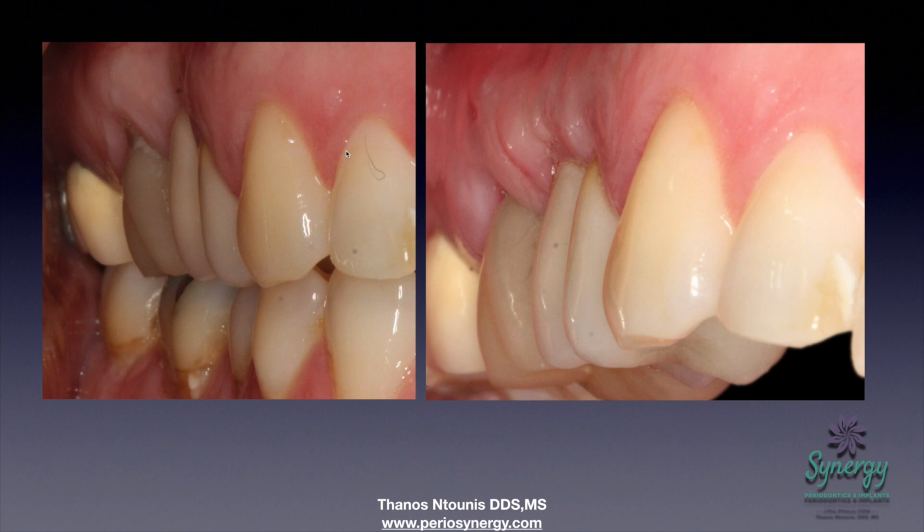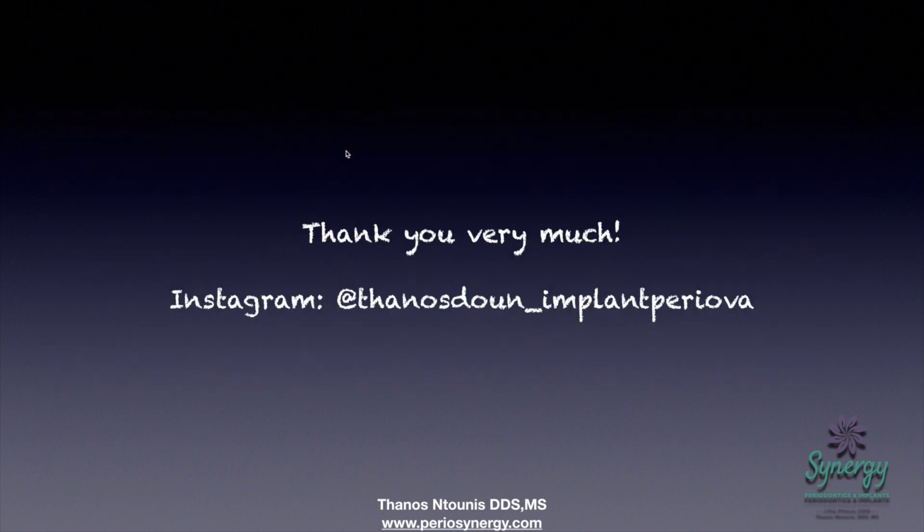So with that, I would like to point out what was important in this case, and why I would like to share it with you. Most of the time I find that peri-implantitis or peri-implant mucositis lesions are associated with the restorative design. And a good restorative design allows for long-term stability of the dental implants. The other thing is the diagnosis of what's going on. Is there a lot of bone loss around that implant? When do we need to keep an implant? I think that was a very clear-cut decision in that particular situation.